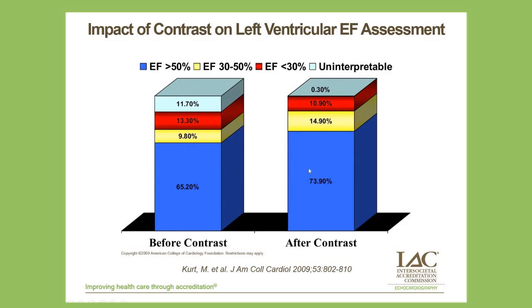In addition to that, several of the ejection fraction assessments here, which are shown in blue for greater than 50%, yellow for 30 to 50%, and less than 30% in red, were changed when using a contrast-enhanced echo. In fact, these investigators found that in over 35% of the cases, the use of contrast added to unenhanced echo resulted in either a change in the diagnosis that led to a change in medical management, or it led to one less diagnostic procedure required to understand the patient's diagnosis.